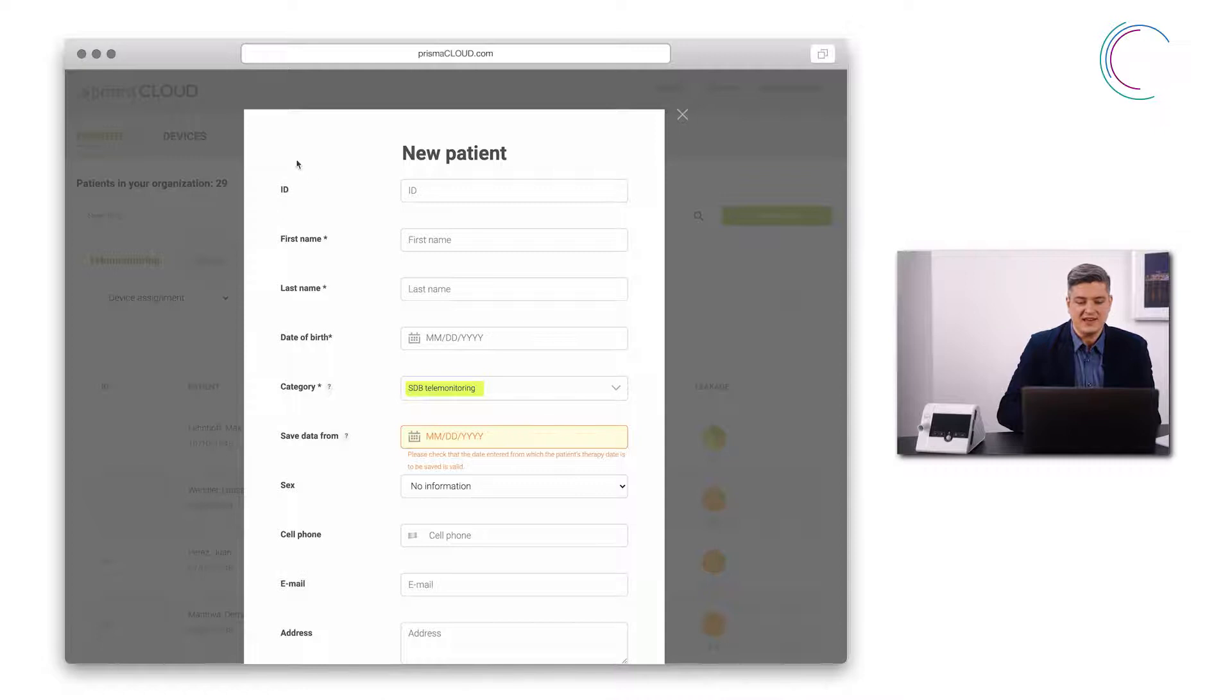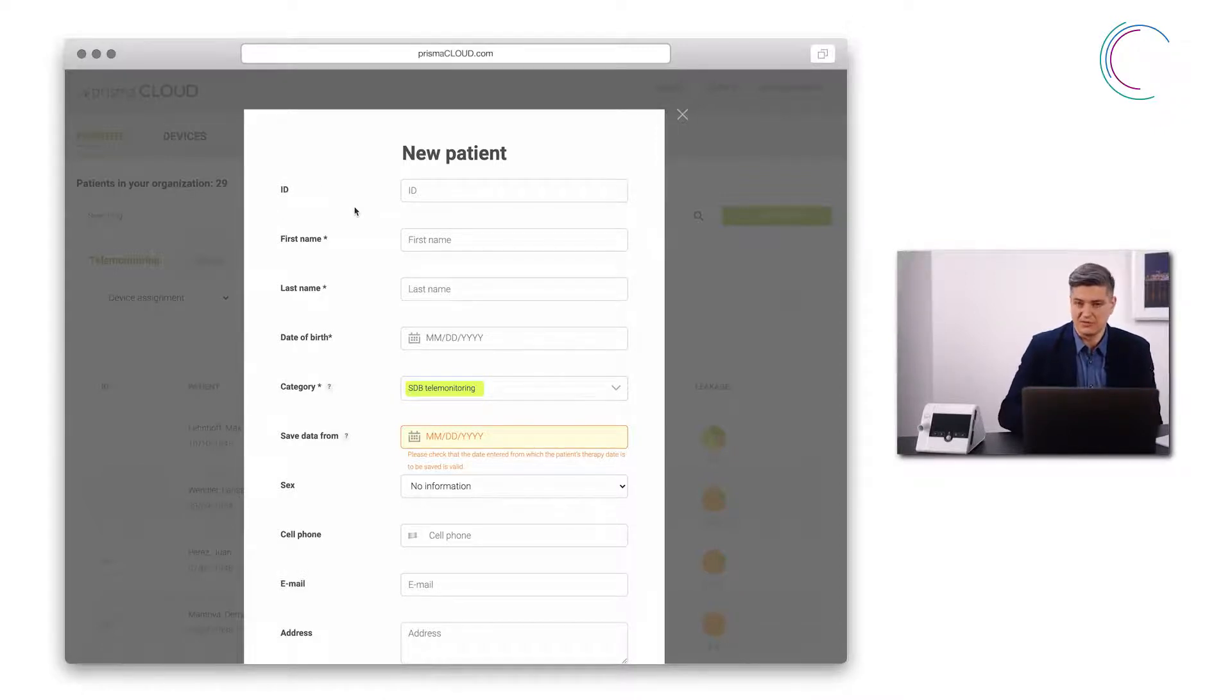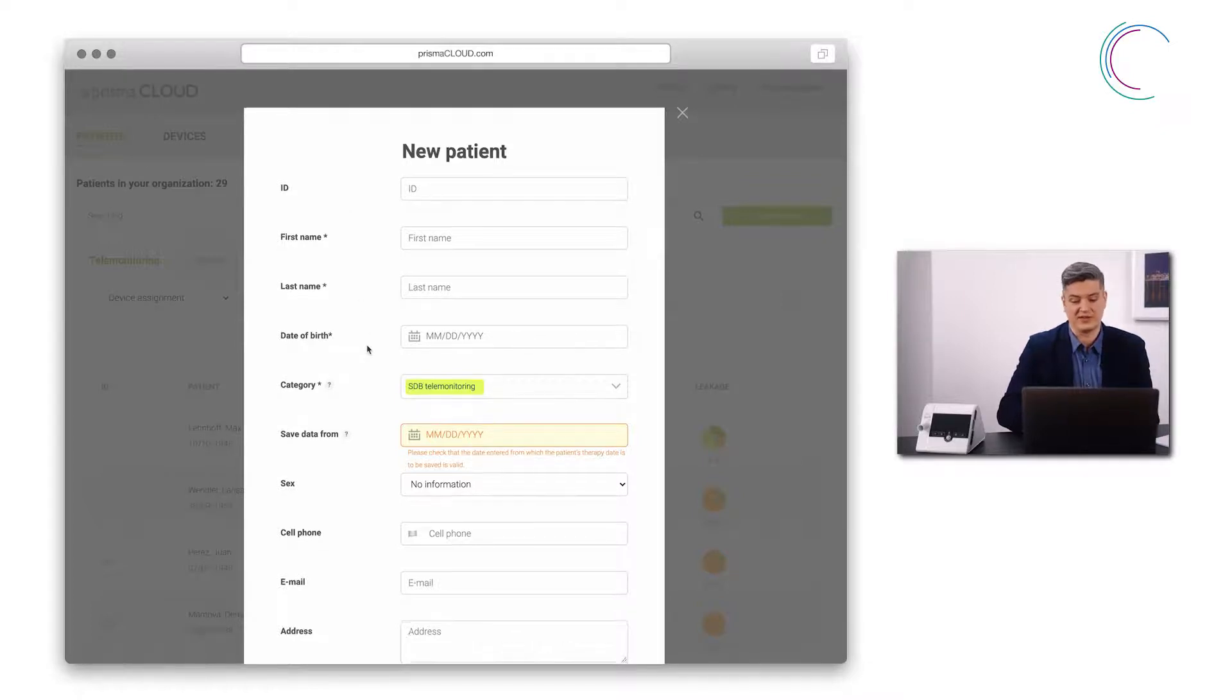The ID is an identification code that can be chosen freely. First name, last name and date of birth are clear.